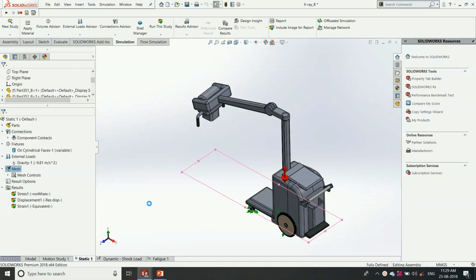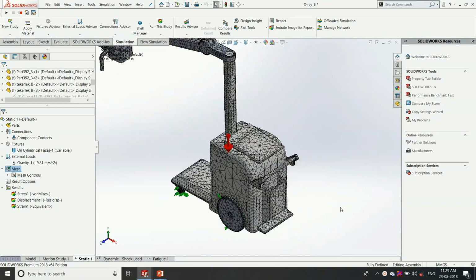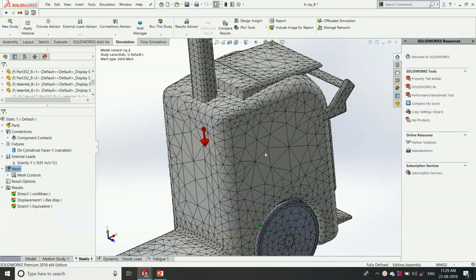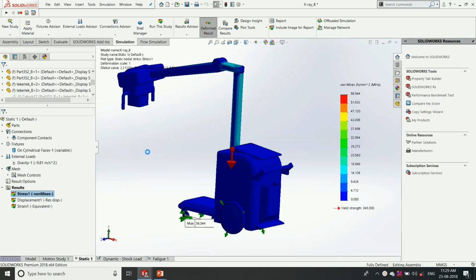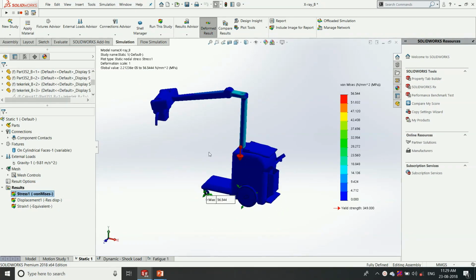So by meshing the model, we will mathematically split the component so that mathematical equations can be performed through each mesh and nodal element. So this is the meshed model, and after running we will get the stress values. Through the stress values we can find what the load concentrating areas are.